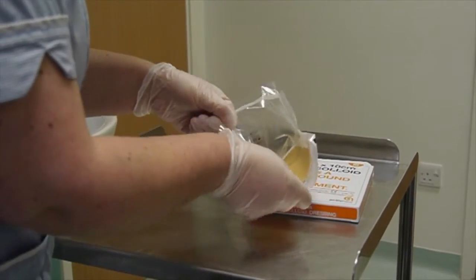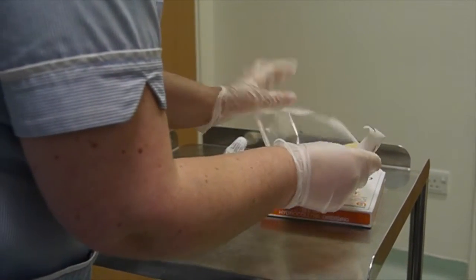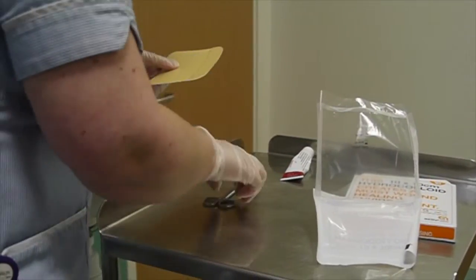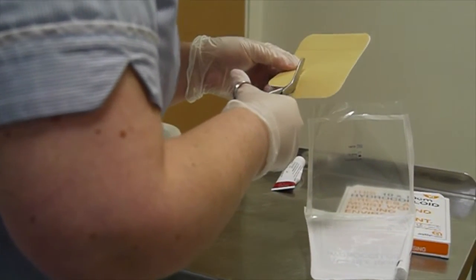The dressing packet is opened and, using a pair of scissors, a piece of hydrocolloid dressing is cut so that it will cover the small patch of eczema and also overlap it by about half a centimeter all the way around.